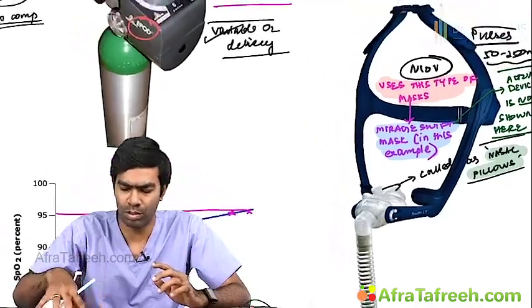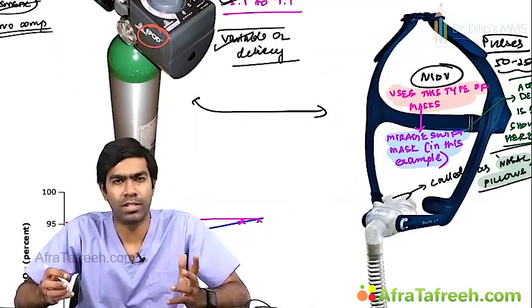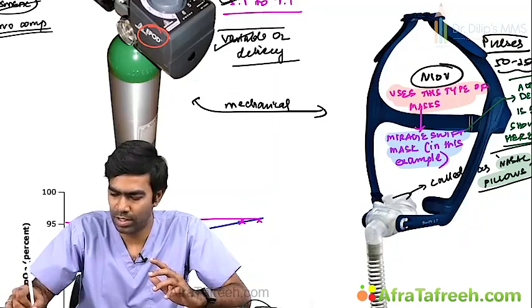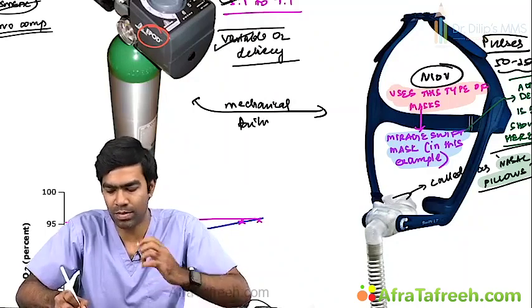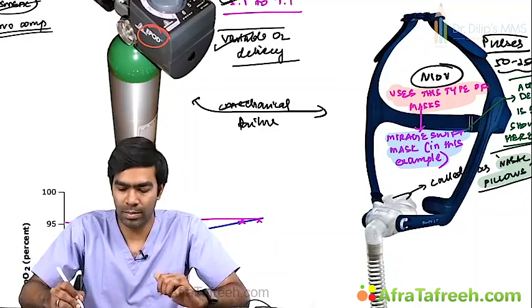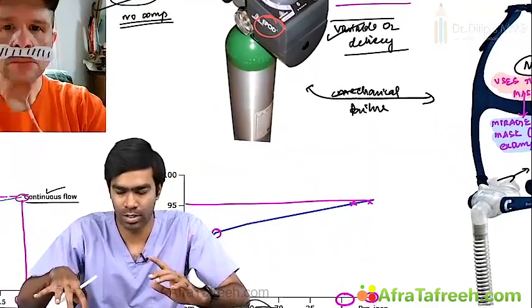And again, both the NIOVs as well as these pulse delivery devices are prone to mechanical failure, which means you need an engineer to correct these things. The patient may not even be aware of the failure of the device. So they are a little bit more electronic and technical. So that's one complication. Apart from that, they are excellent oxygen conserving systems.